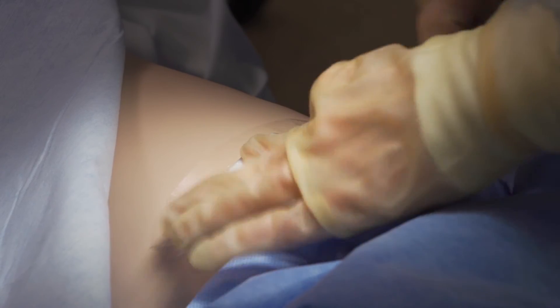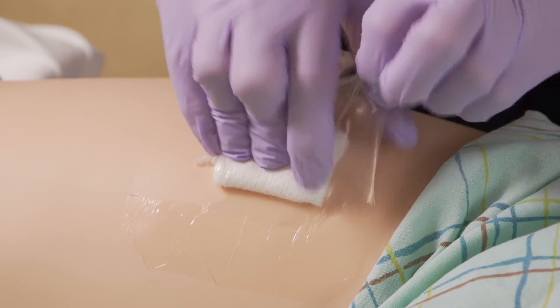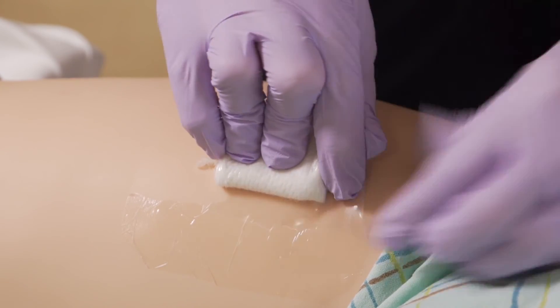You may leave QuickClot in place for up to 24 hours. To remove, gently peel away the adhesive bandage and gently remove the pad.